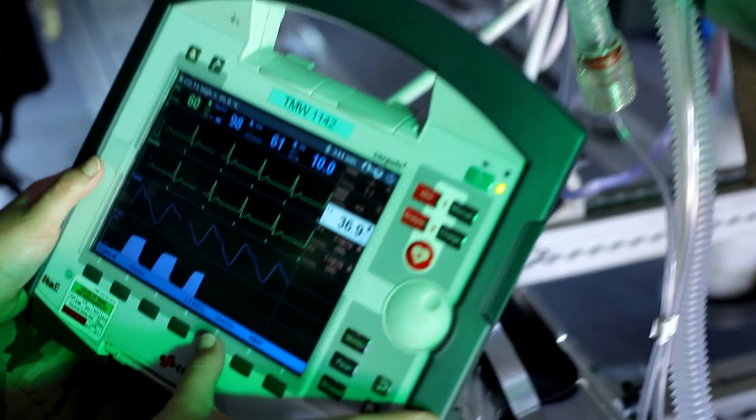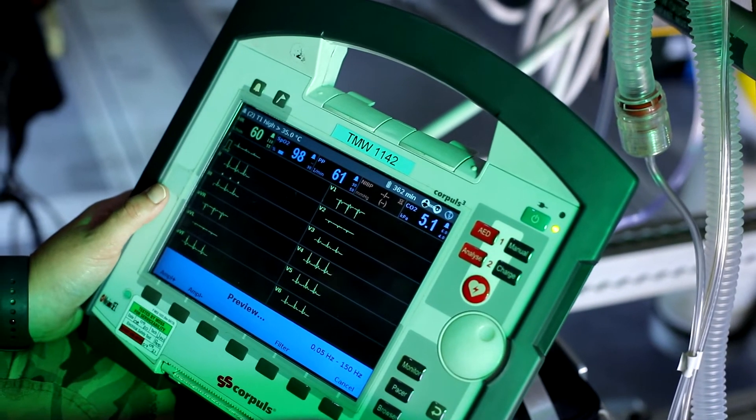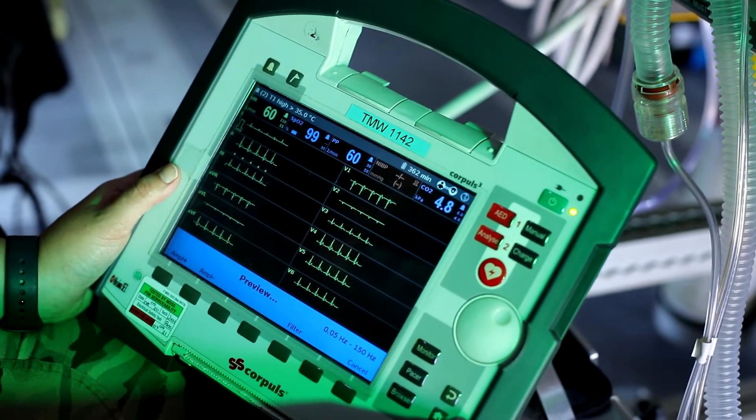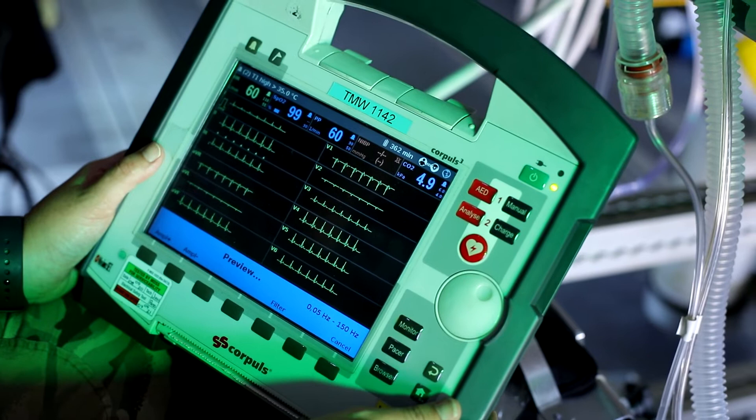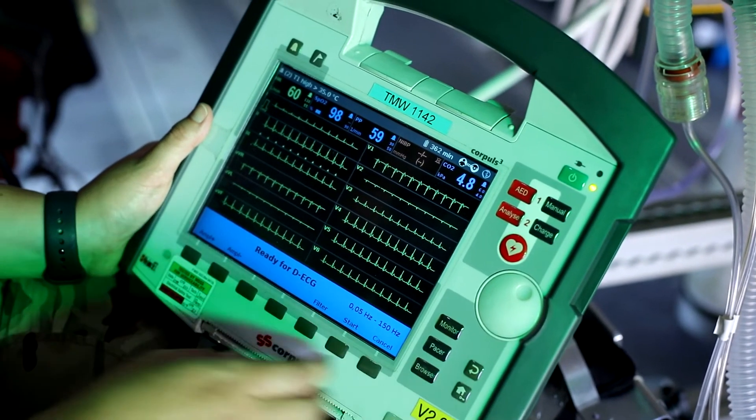The Corpuls 3 provides comprehensive monitoring, diagnostic and therapeutic functions for treatment of emergency and intensive care patients. It's a portable device with a modular structure which can be used as a defib monitor or as a full patient monitor in its own right.